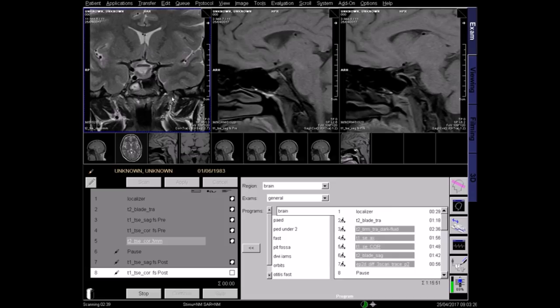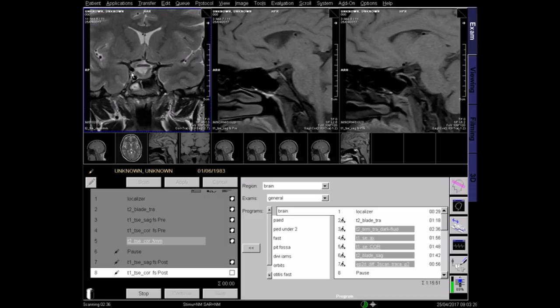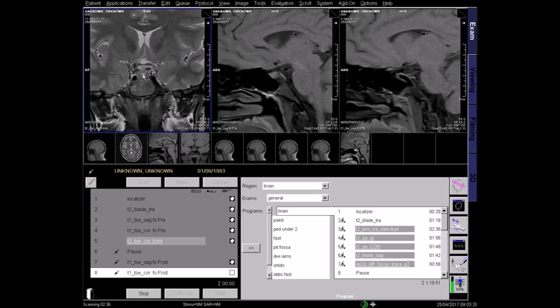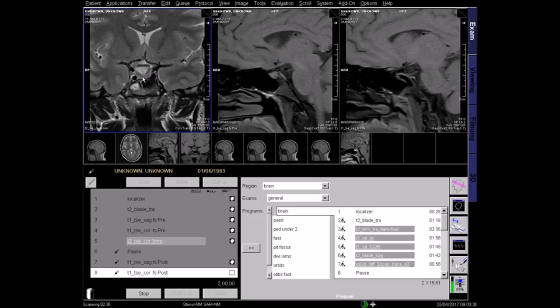This is a T2 coronal high-resolution image. The pituitary gland appears light grey and the CSF appears bright in the T2 images.